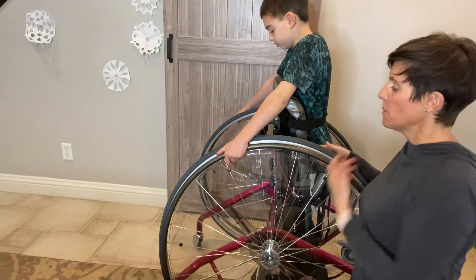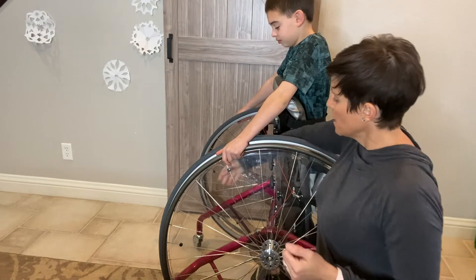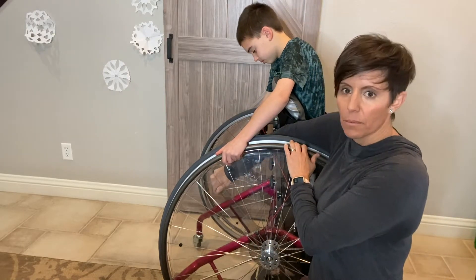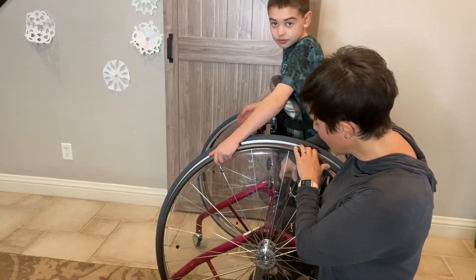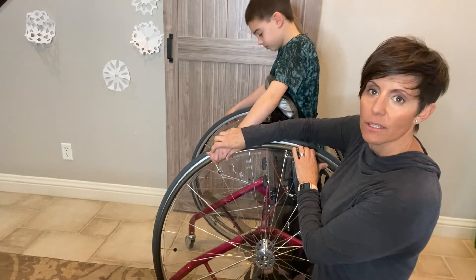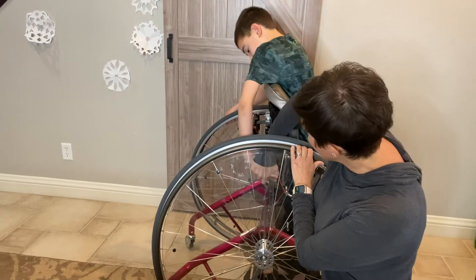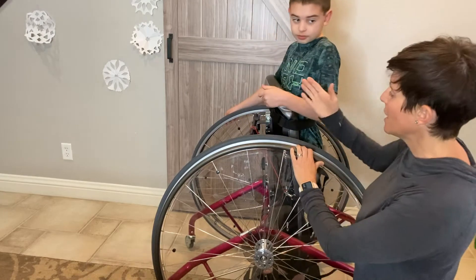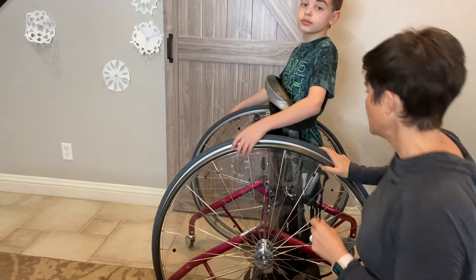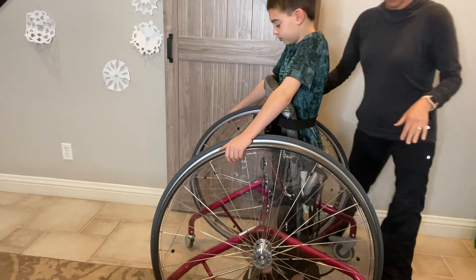Now we're ready to roll. The first thing we're going to do is ask our lovely person to unlock the brakes — this is how you do it. You bring this leg back; it's kind of spring-loaded, so it does take a little bit of force initially. If they can't do it themselves, you can bring the hand down to the lever and have them pull back. You can see as he gets taller he's going to be a little bit further away from this lever, so it is harder to move the taller the child is. Make sure both of those are unlocked.